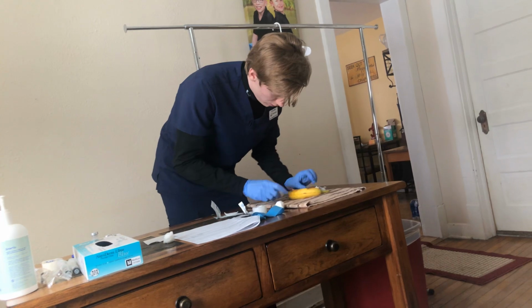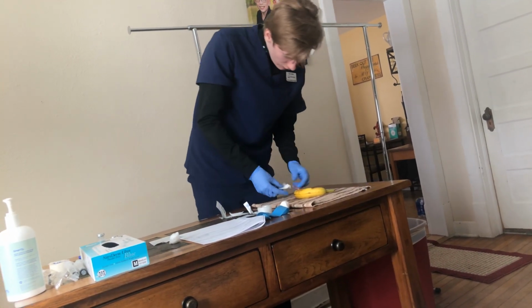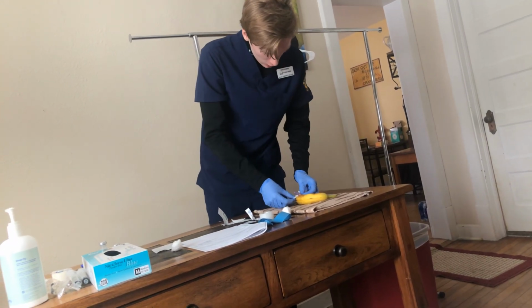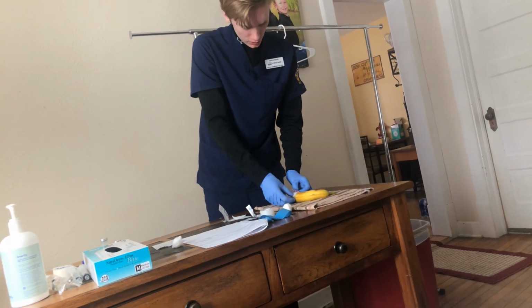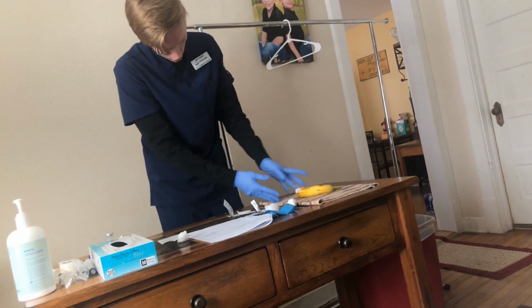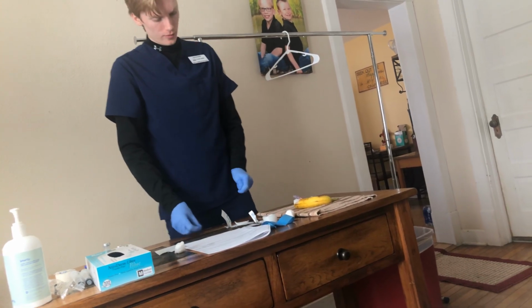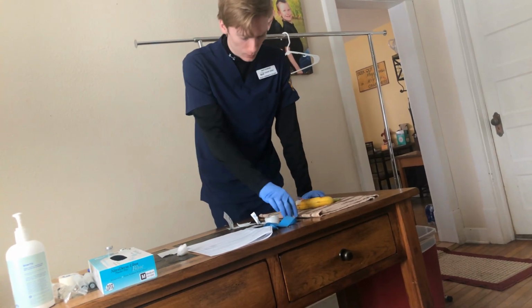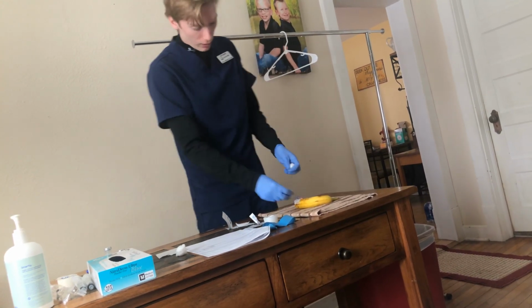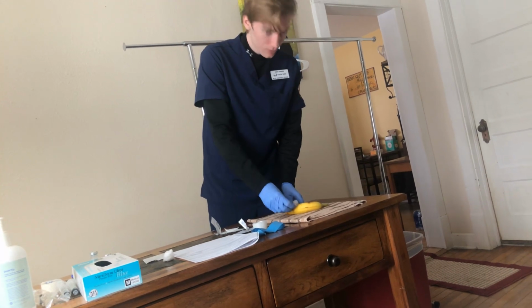Perfect. Discard of all that. Again, this little gauze pad is my way bigger gauze pad. It would be underneath just to catch anything if something was to come out. Now that we have all that hooked up, we are good to take out the catheter. So, I'm going to get this and get some alcohol, clean around the site. Not on it, but just around it.